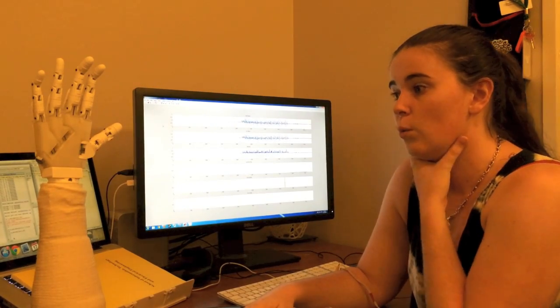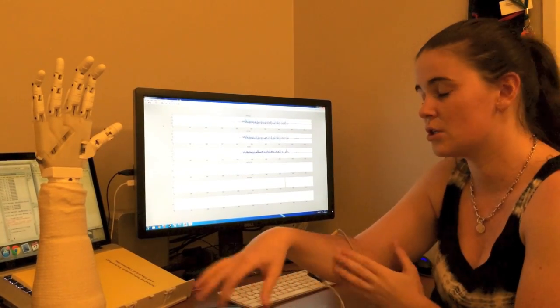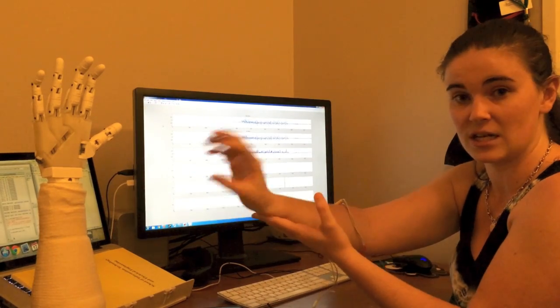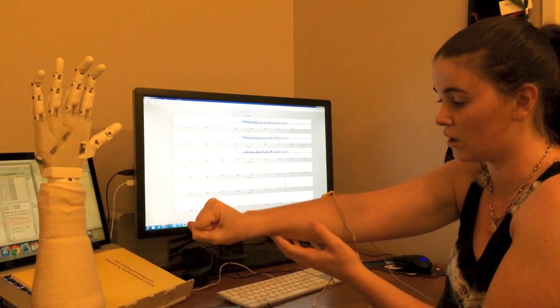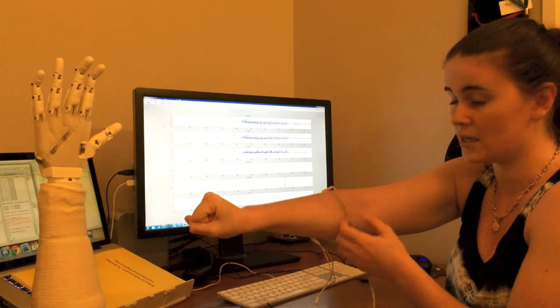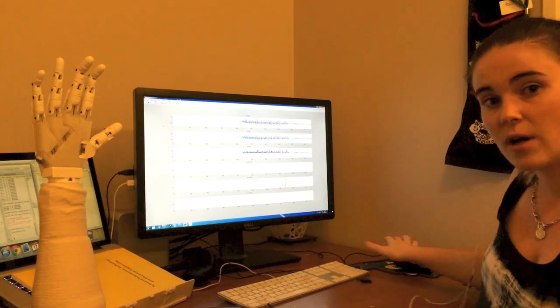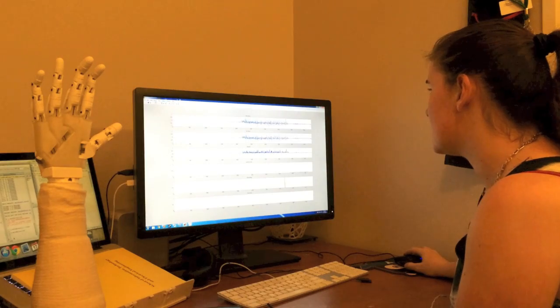So what I want to do is then take a series of motions. Looking at those states that we looked at, the flexion, extension, and the grasp, I wanted to put a series of motions together. So I'll run the code for that so we can see how that works.